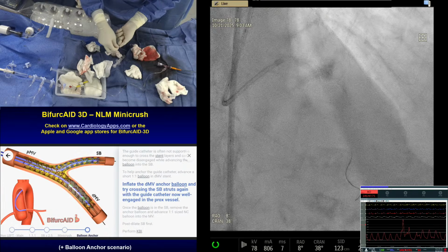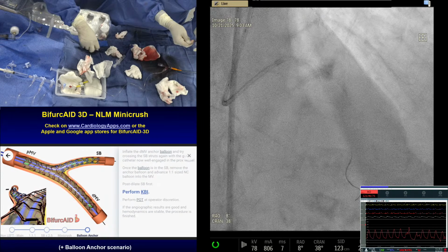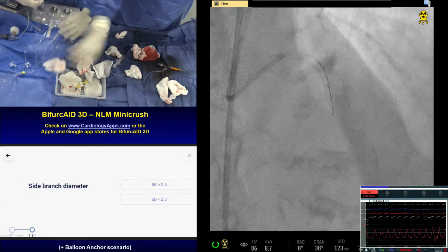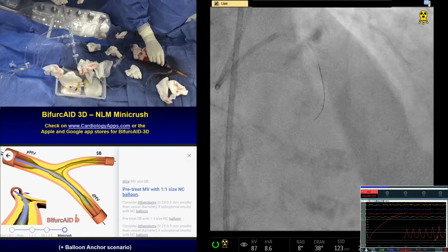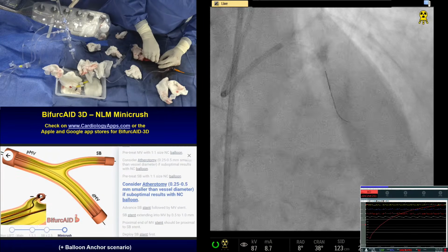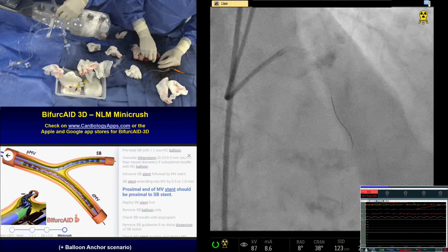Okay, we are going to see the pictures now. Good. Fielder wire is okay. Yeah, new Fielder wire. No, I think it's good. Okay, let's take a picture. Wire further. Anytime you make sure the spring portion of the wire is not in the lesion, you'll never see the dissection otherwise. Go distal. Another nice point for people to learn.